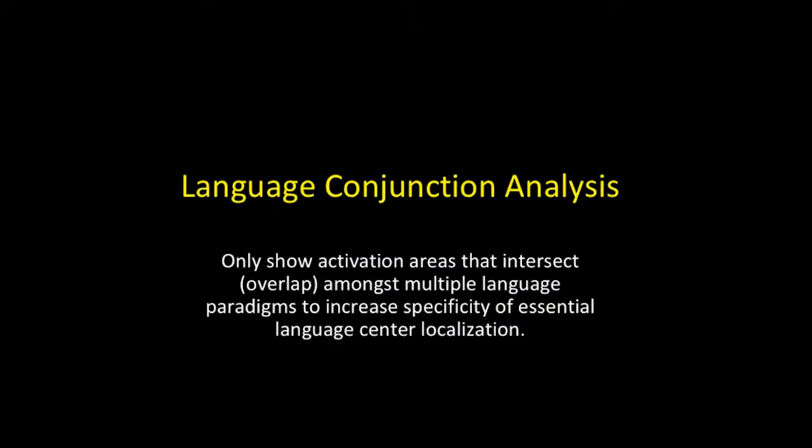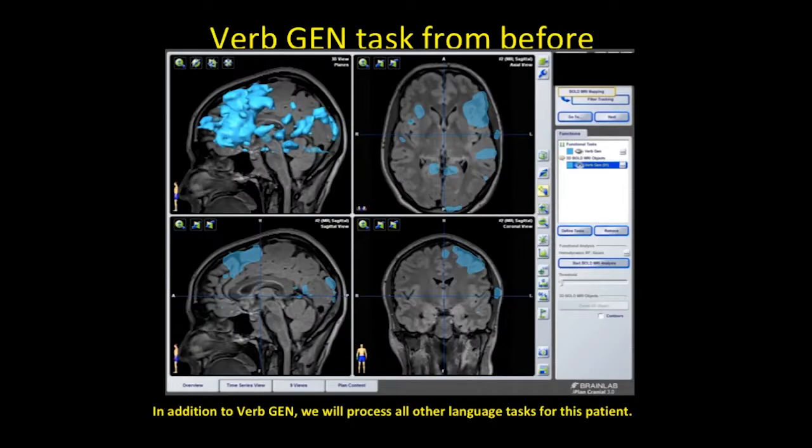This brings us to the next part: the advanced language analysis of bold data. What we just went through is conventional, one task at a time. With conjunction analysis, we're going to show activation areas that intersect or overlap amongst multiple language tasks to increase specificity and our laterality index, so we can see essential language center localization and more easily ignore noise in our data. It's also easier for trainees to understand the language data.